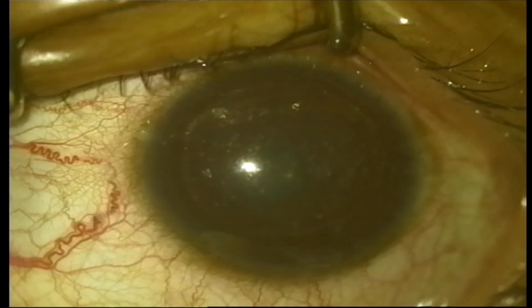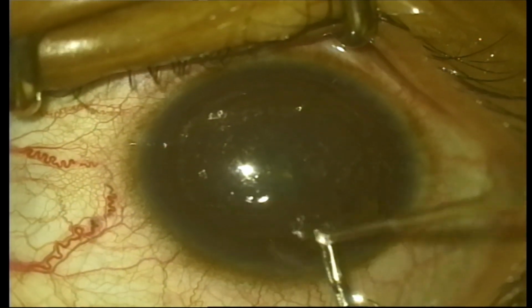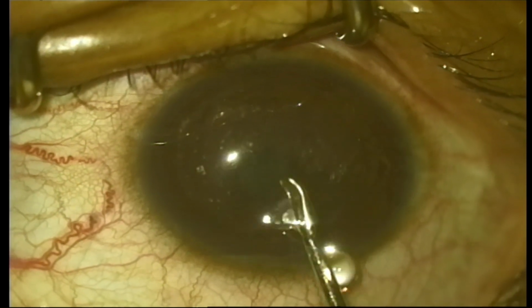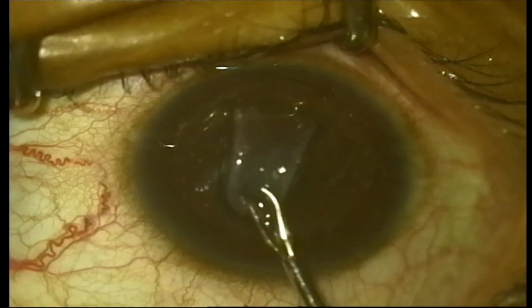So you can see now it's a floating lenticule. You can hydro dissect it also, but I use this forceps to just hold it. There's a small tag here, take it out, and you can spread it out.